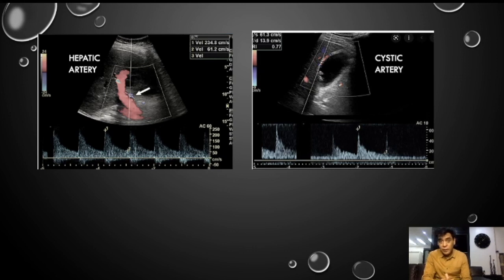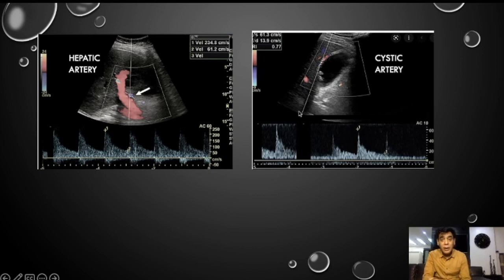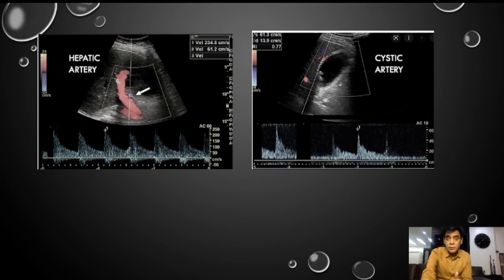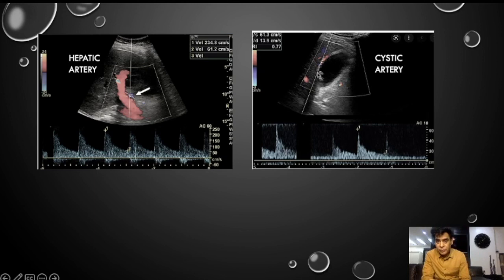For cystic artery Doppler, we have to do the sampling within the wall — you have to see this flow within the wall. Although the flow in the wall may be absent in a normal case, in cases of acute cholecystitis we are usually able to get the flow. We can then do the sampling of this flow, which is the cystic artery flow. The angle has to be less than 60 degrees; most of the time when it is quite parallel, the angle is good enough.